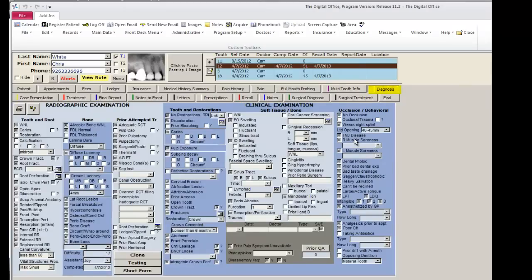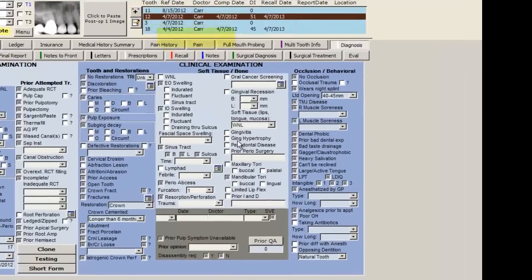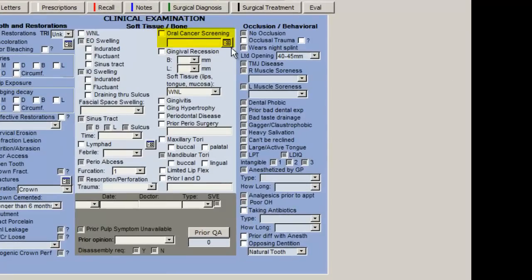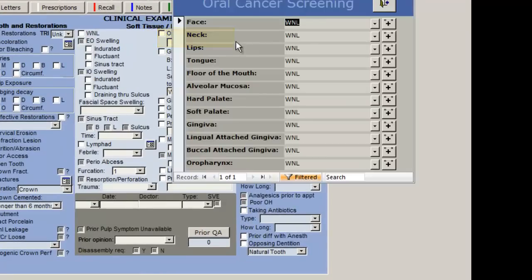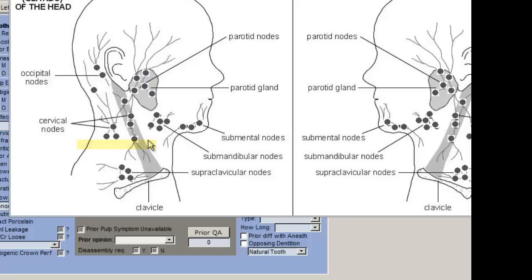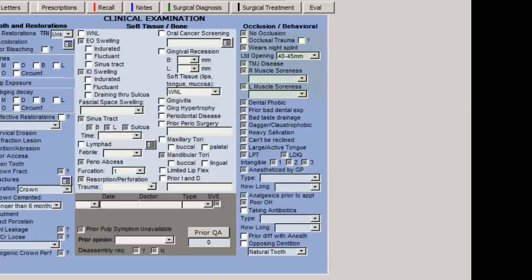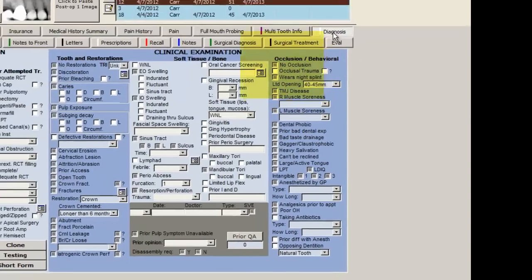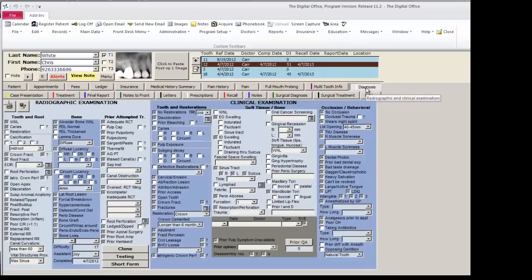The next step in the flow is to go to the diagnosis page. At this point, you are just going to conduct a general soft tissue exam, and this includes oral cancer screening, lymphadenopathy, and muscle mastication. Later on, we will do a much more detailed examination.